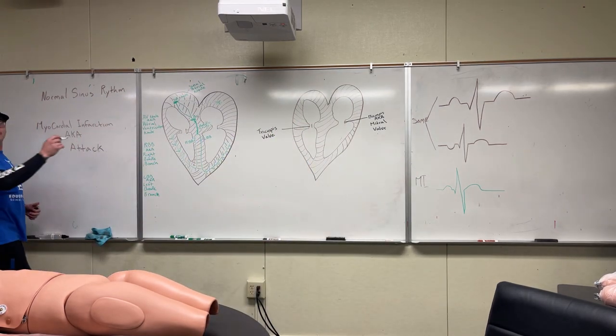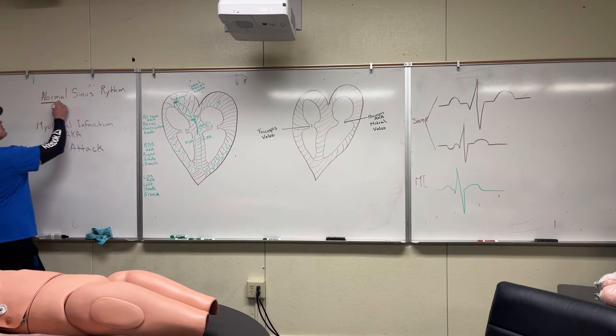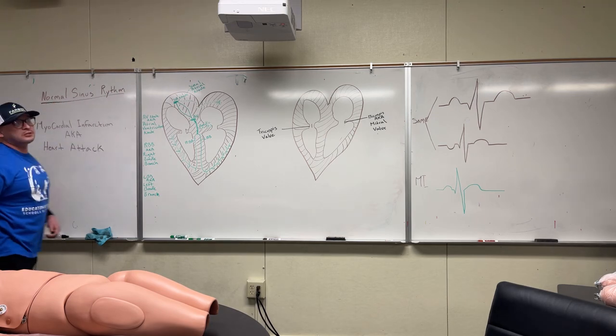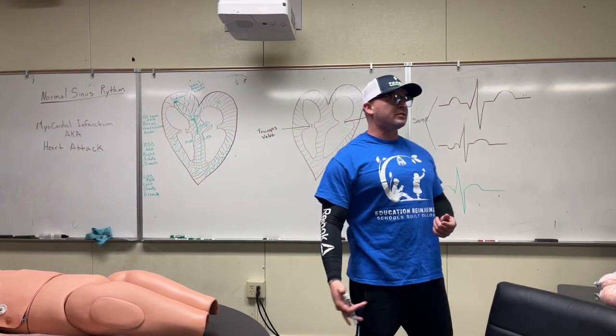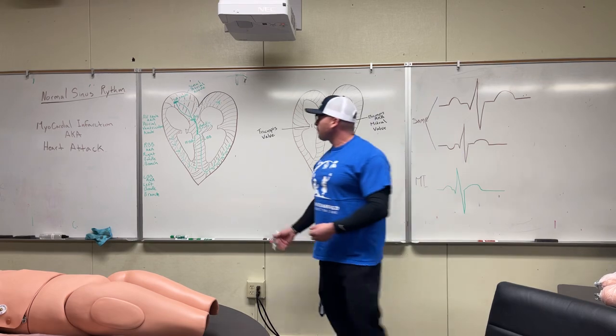So the first thing we're going to cover is going to be a normal sinus rhythm, okay? So that's a normal heartbeat. Normal sinus rhythm is a different way of saying normal heartbeat, okay?